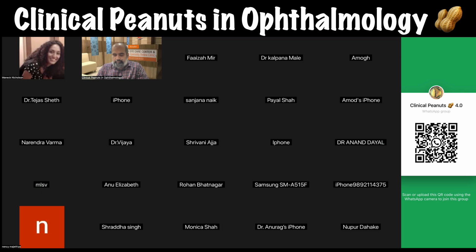Okay. But initially, if there's any corneal edema or something, and we defer that till the edema subsides, suppose the patient comes around 1 week later, then is it still fine? Yeah, that's fine. The bag is not going to fuse or anything in 1 week. You can do it a week later. I don't think it should be an issue. But try doing it as early as possible is what we advocate. Okay. Thank you, ma'am. Thank you.